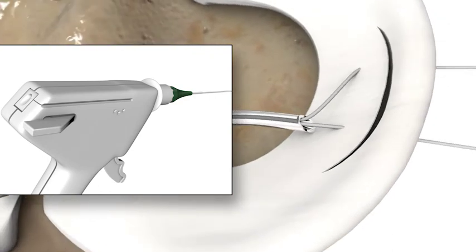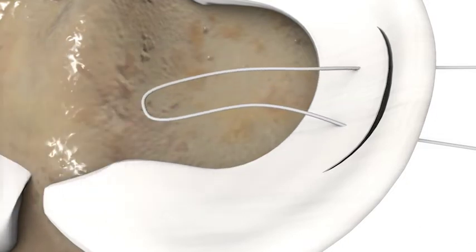After advancing the second needle and removing it from the knee, carefully remove the gun and cannula out of the knee, leaving a suture loop behind. Ensure the suture does not get caught on any part of the gun when removing.